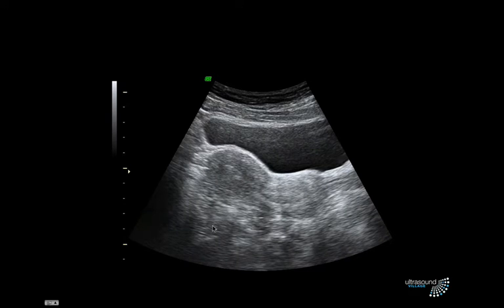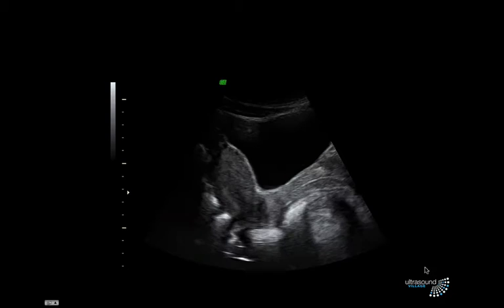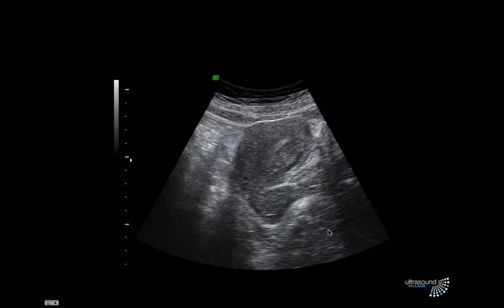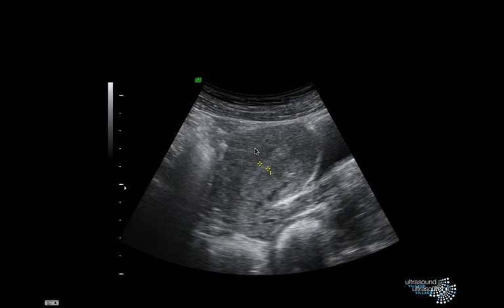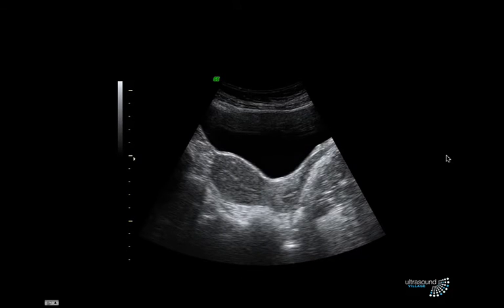And another one. You see, this isn't rocket science, it's pattern recognition. And another one. And another one. It all looks the same. Vagina, uterus. The size of the uterus might vary, the size of the bladder might vary. So here we have the empty bladder, and then as it gets a bit fuller, it pushes the uterus back. And fuller still, until you've got a uterus that's almost lying perpendicular to the direction of the ultrasound beam.